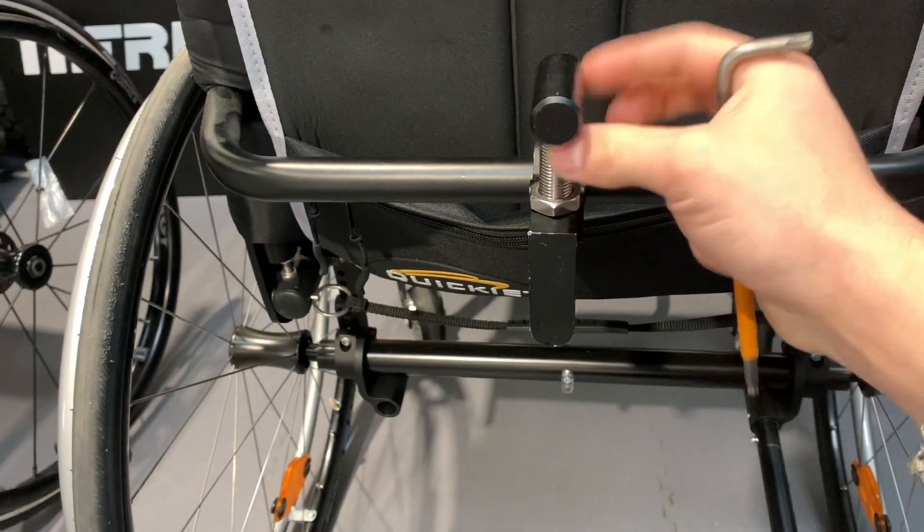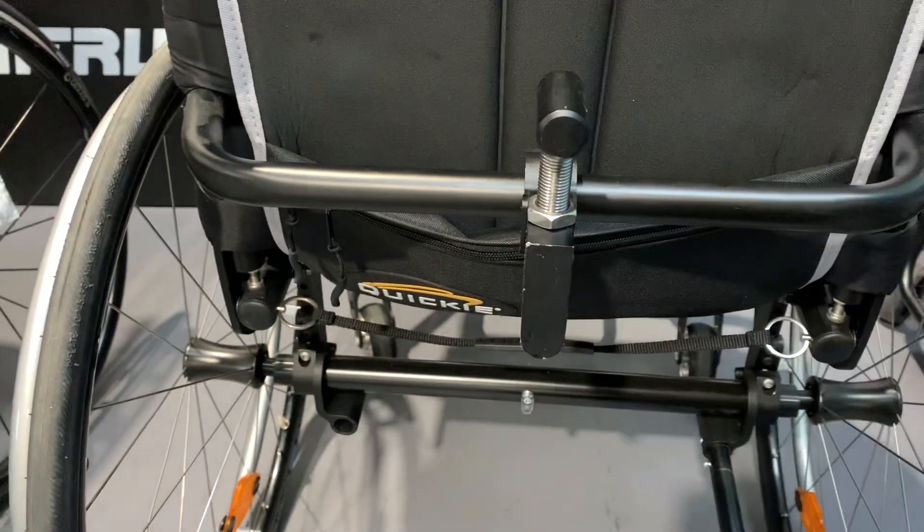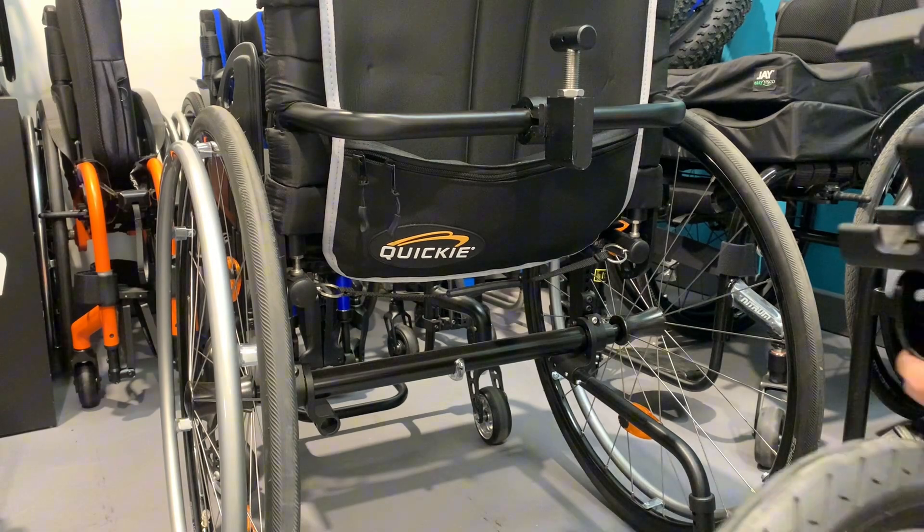And when it's in the position where it does clamp, you then tighten this nut, keeping this as straight as possible. So now you know how to fit it.